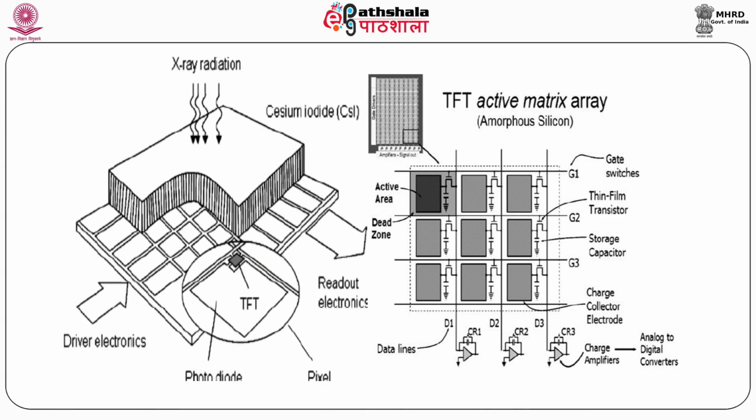The time varying analog signal is processed for amplitude, scaled and compressed. Sampling and quantization take place. Further, the imaging plate is erased so that it can be reused for another exposure without any ghosting.